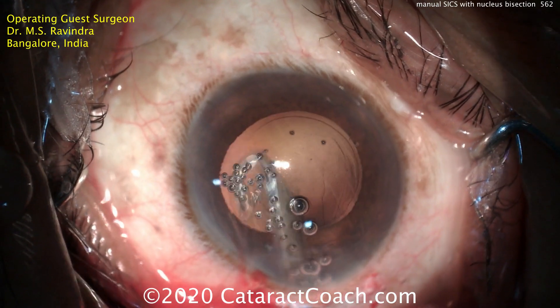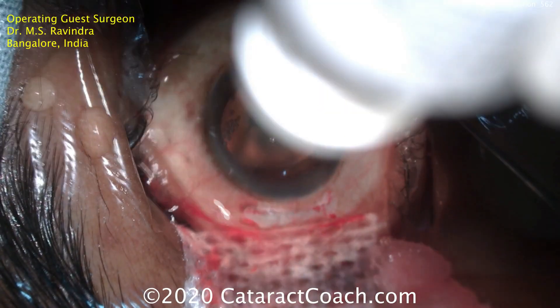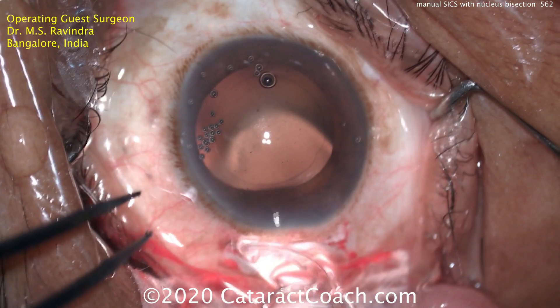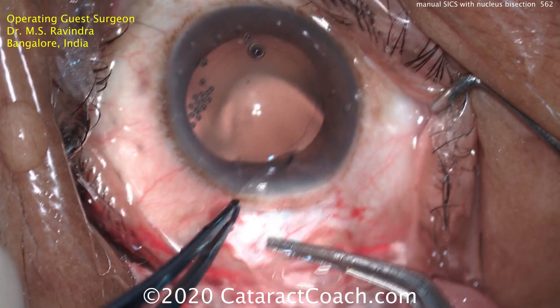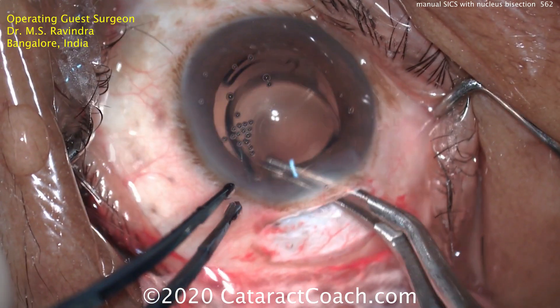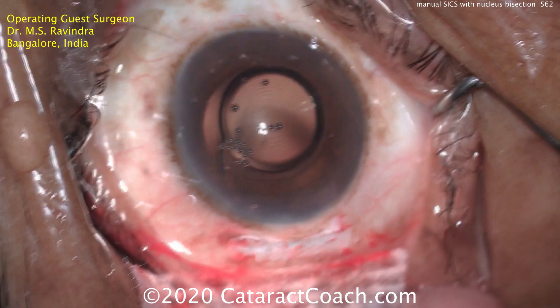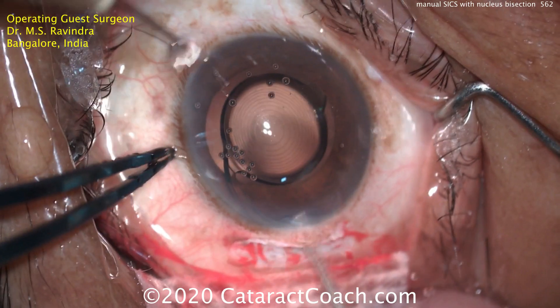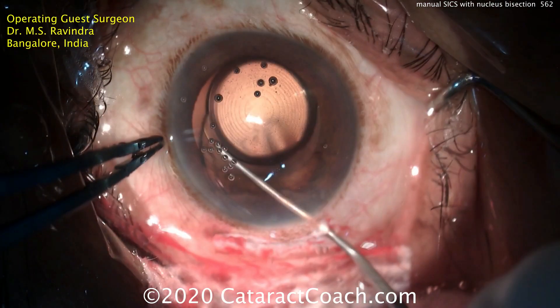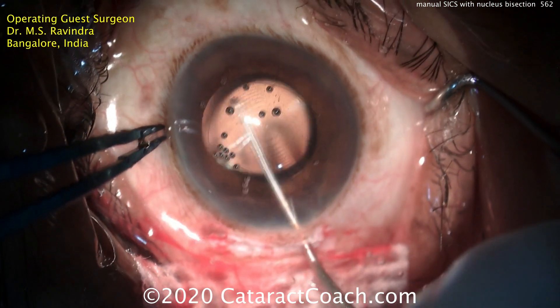Even with a relatively dense nucleus, this is a very efficient technique. A little more viscoelastic going in the eye to fill the capsule bag. Now, because the incision is six millimeters, you don't have to fold the lens. You can just hold the lens at the haptic-optic junction and gently place it inside the eye and into the capsule bag — very efficient. You don't even need a lens injector. A little more viscoelastic to position the lens, then dialing in the trailing haptic. The entire lens is now beautifully set in the capsule bag.